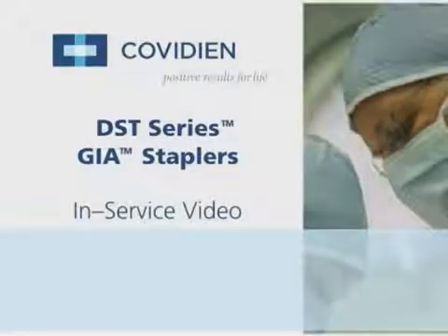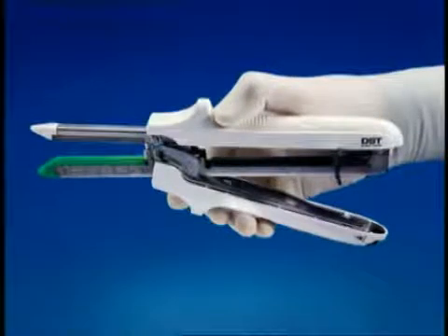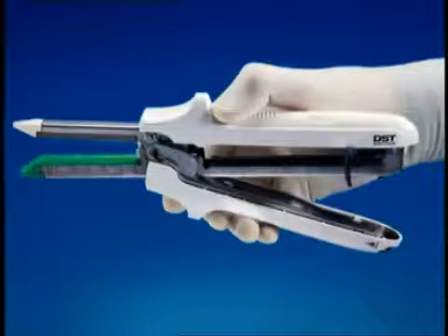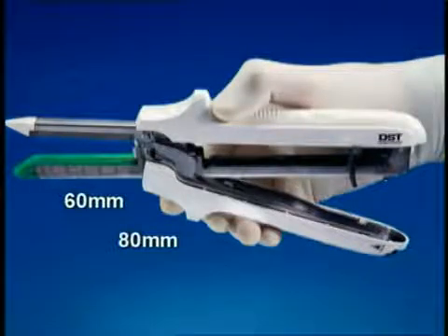This in-service video provides basic instructions on using the DST series GIA staplers. Please refer to the instructions for use packaged with the product for more information. The DST series GIA staplers place two double staggered rows of titanium staples and simultaneously divide the tissue between the two rows.